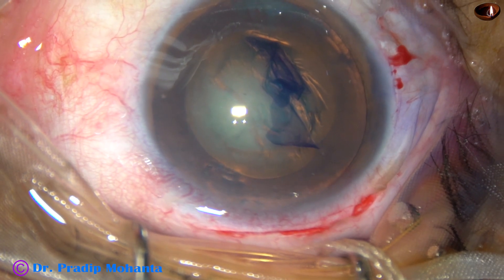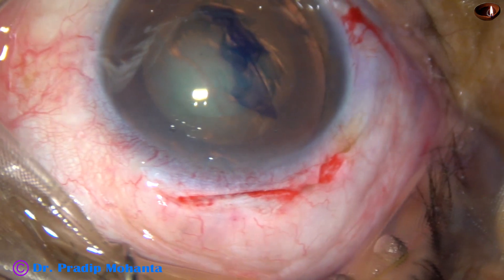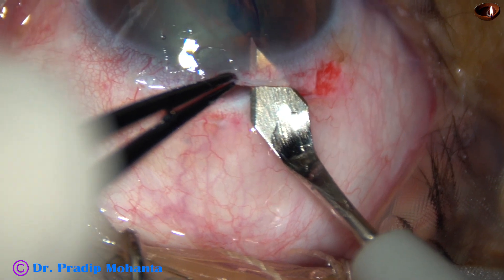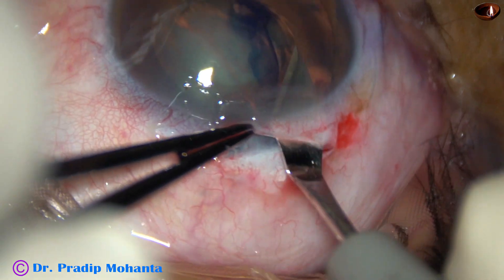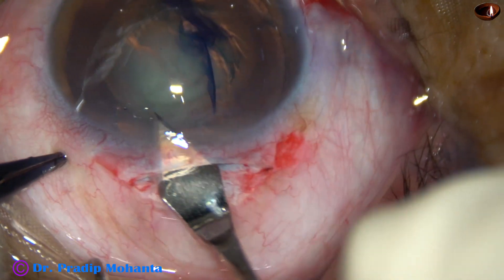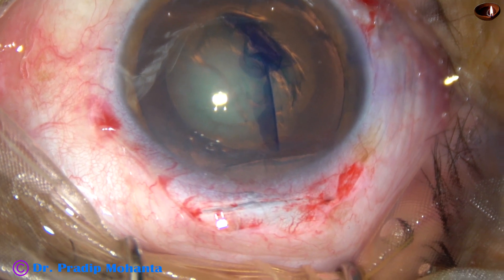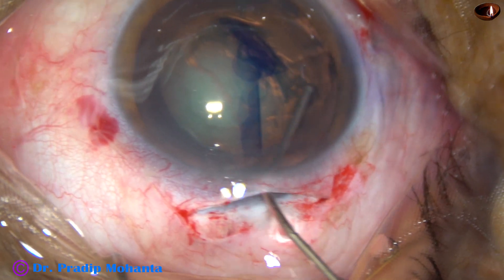Now the tunnel is to be opened. So long the tunnel is blind; now the tunnel will be opened. Go to the anterior extreme of the tunnel, then turn inward and enter into the anterior chamber. Cut as you go forward from one end to the other end and open this tunnel. This is the passage for nucleus delivery and intraocular lens implantation.